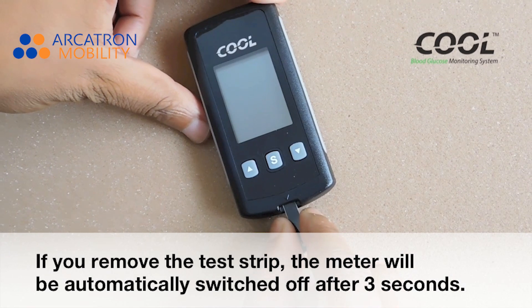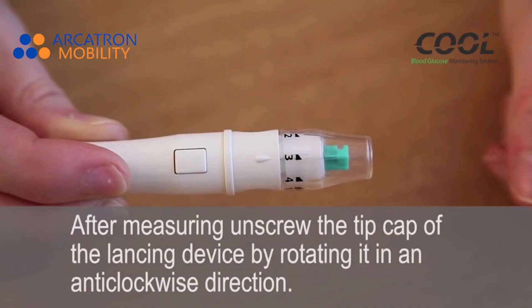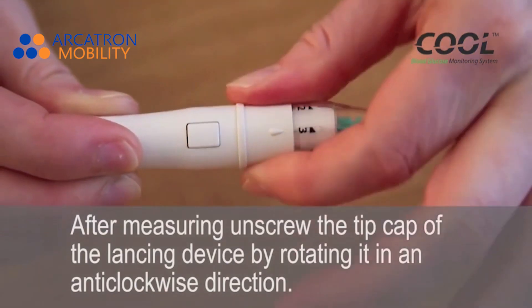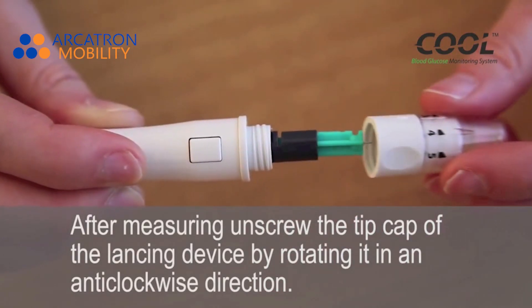If you remove the test strip, the meter will automatically switch off after 3 seconds. After measuring, unscrew the tip cap of the lancing device by rotating it in an anti-clockwise direction.